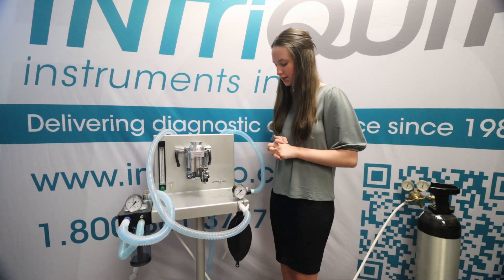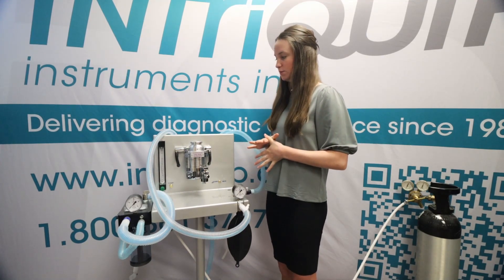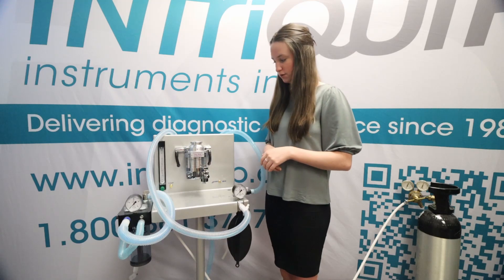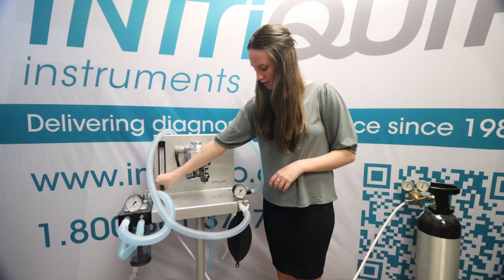I'm going to be demonstrating a basic veterinary anesthesia leak test on this system here. This should be done prior to any surgery that's going to be using anesthesia. The first thing you're going to do is make sure that your oxygen supply is turned on and your flow meter is turned off.